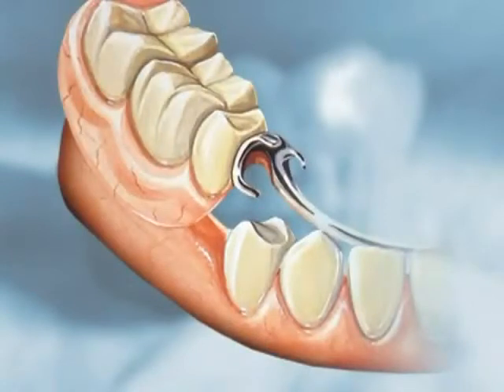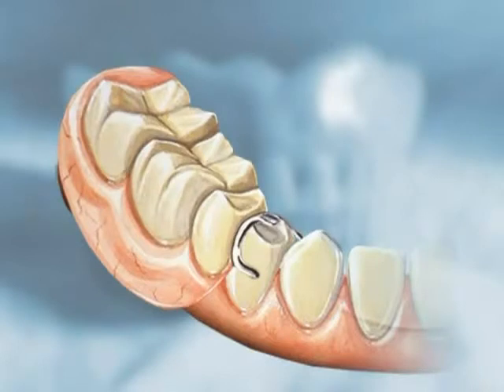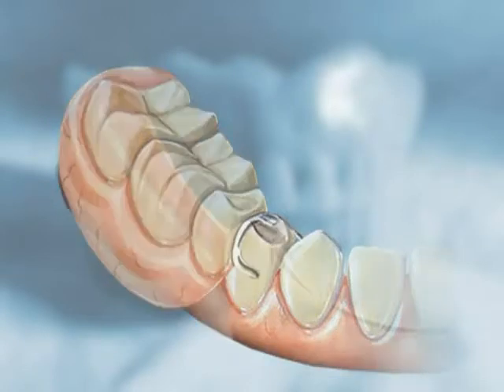Metal clasps are C-shaped parts of the denture framework that fit around neighboring natural teeth. These teeth may require shaping to help hold the clasps and keep the denture securely in place.